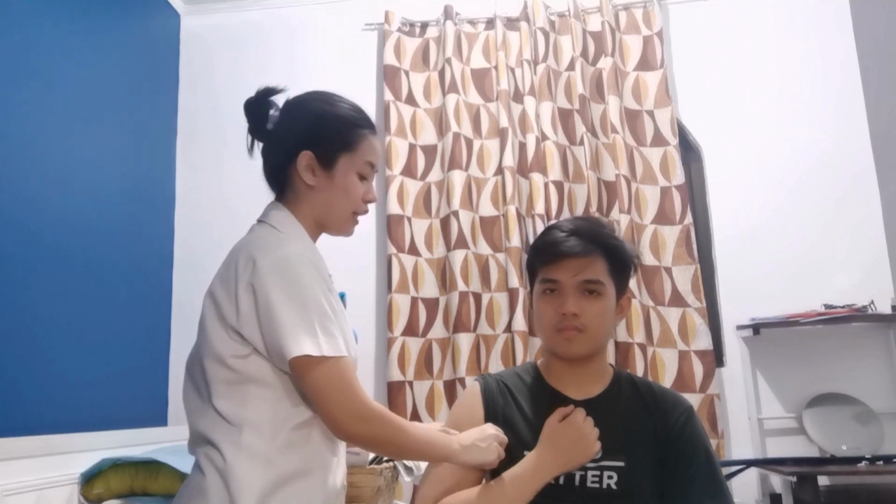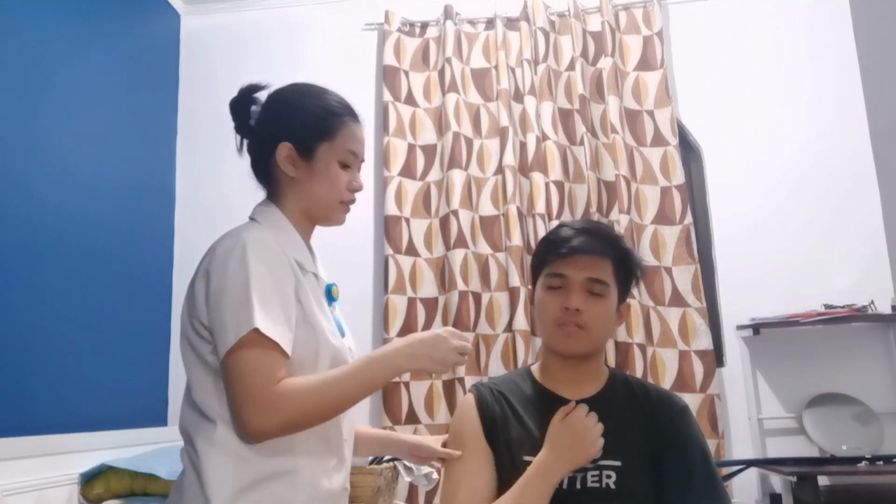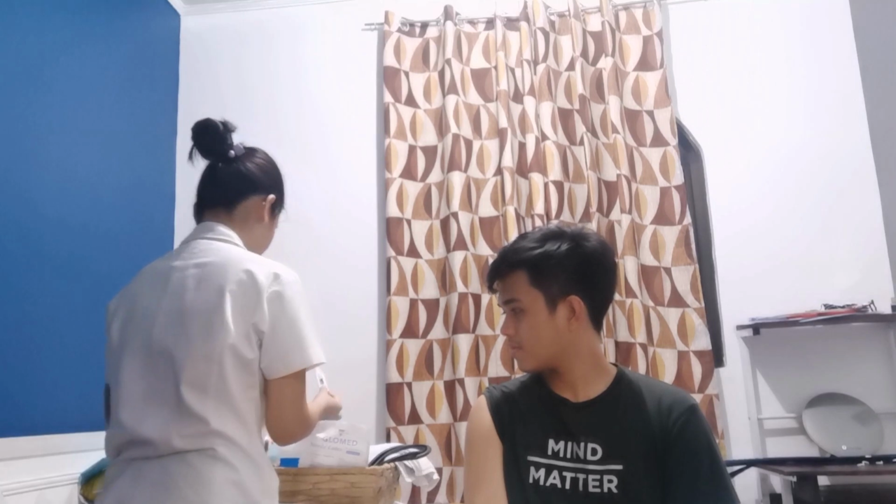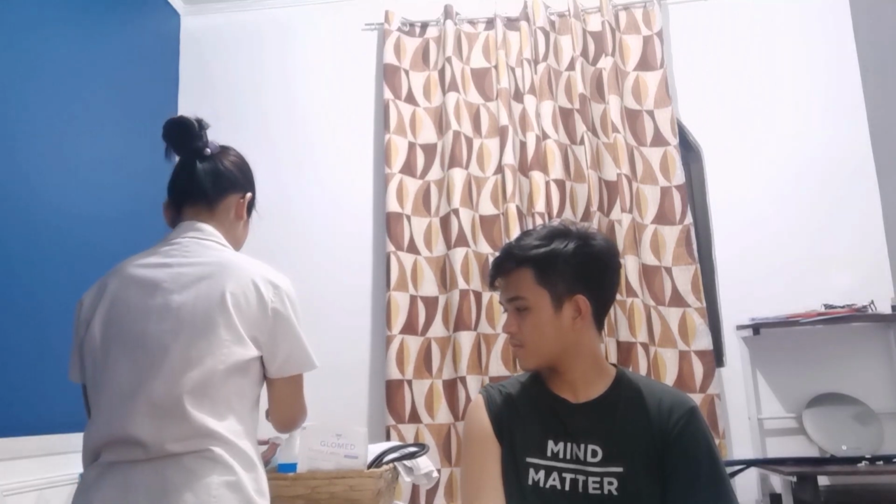Remove the thermometer when you hear a beeping sound. So the reading is 36.7 degrees Celsius. After removing the thermometer, wipe the thermometer with cotton balls and alcohol in a circular motion to clean off the sweat, starting from the bulb up to the stem.